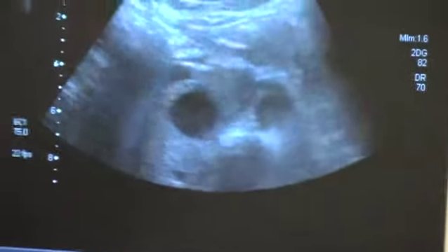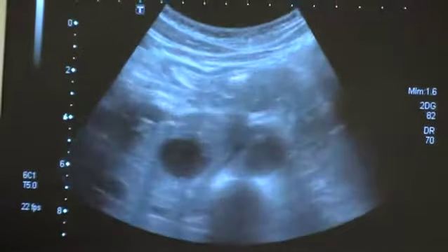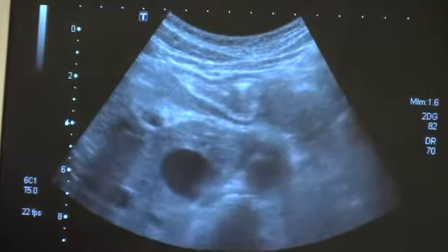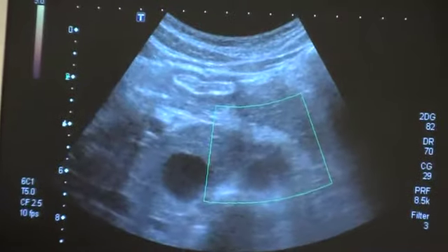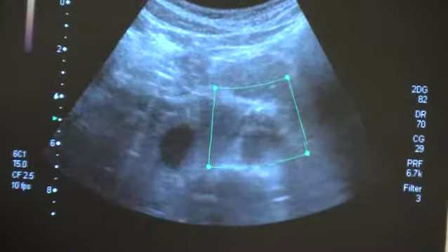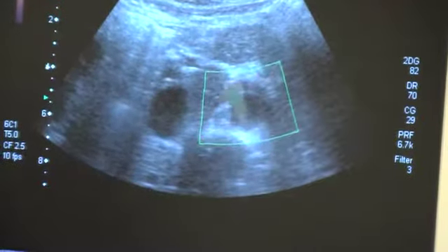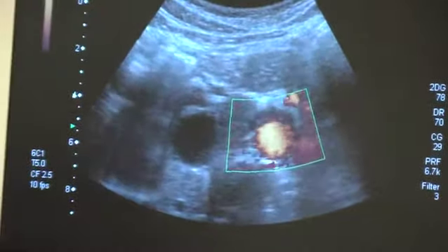It's right through there. One way that we can try and enhance our image is by applying a little power flow here. We can set our box by hitting the set button. It gives us 4 corners to manipulate our box. Press set again and drag over the area of interest. Decrease our gain on that just a little bit. Oh, the color gain is on the CDI button. I just figured that out. If you turn the CDI knob.